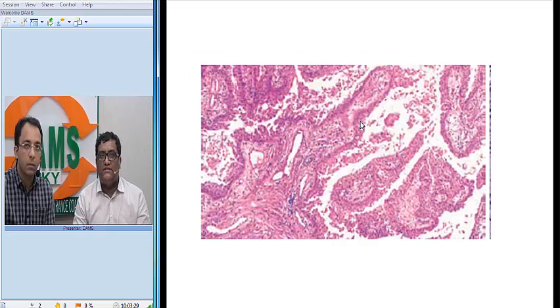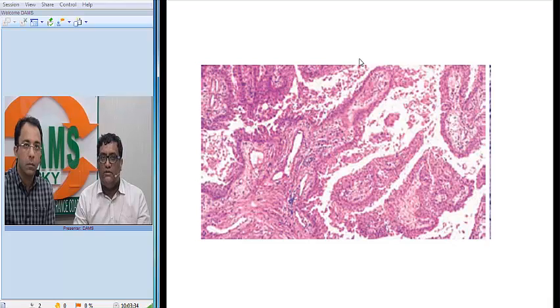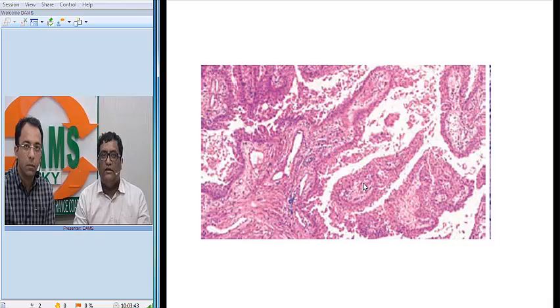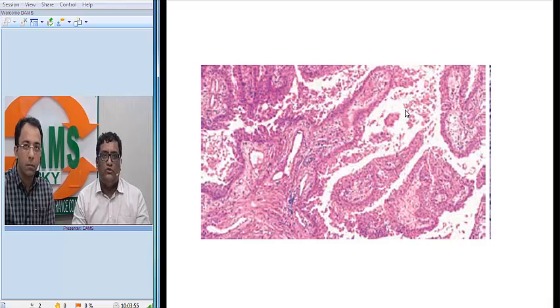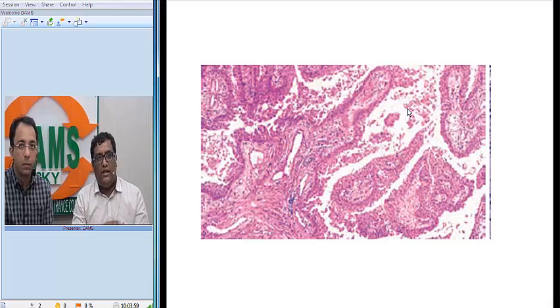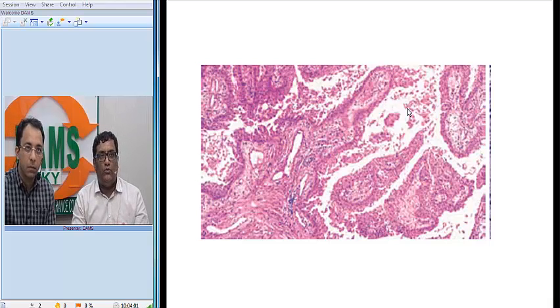In the cystic areas, we see multiple papillae with blood vessels in between — finger-like projections. There are cross-sections of papillae with blood vessels in between, and empty spaces that were probably filled with the characteristic cystic fluid that was drained during processing. So papillary areas can be present alongside adamantinomatous areas.